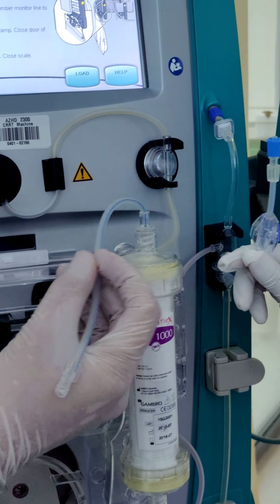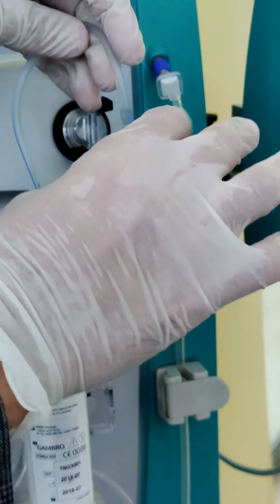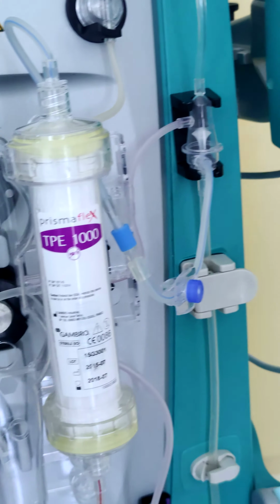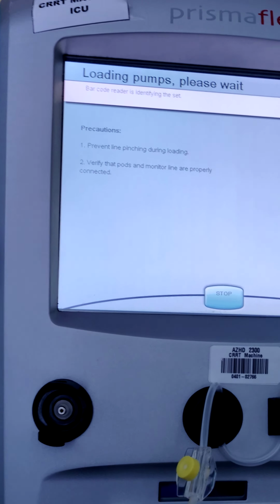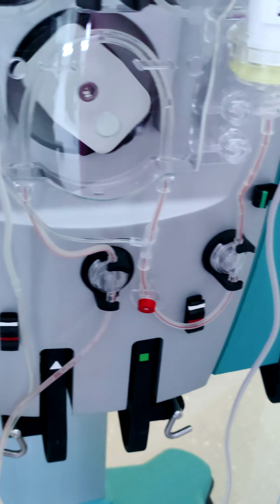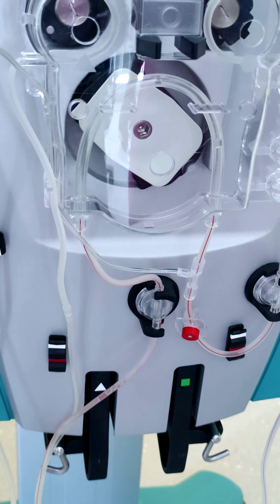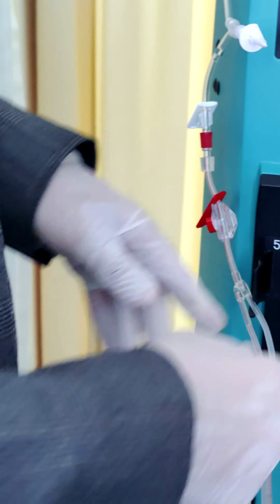This one was on the back. This one should be connected here, sorry. It's coming pre-connected, but this is a demo only. Set. Load. All the clamps should be unclamped. By default, it comes unclamped, okay? Replacement, you are not attaching now? No, not yet.